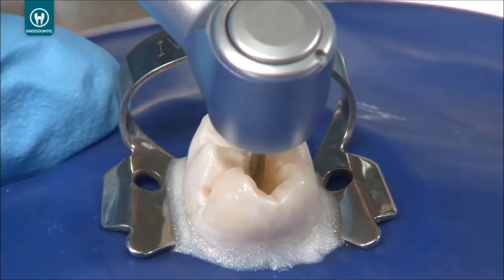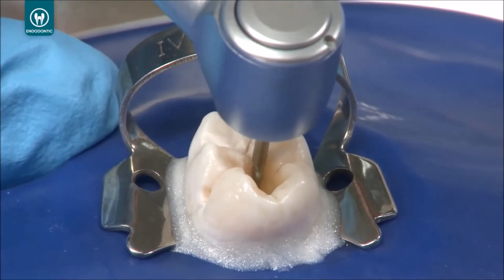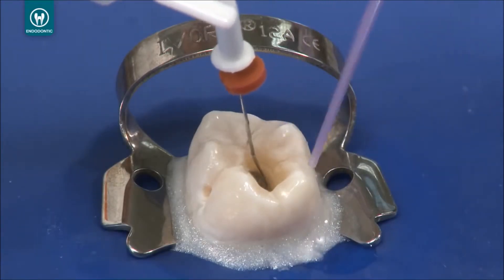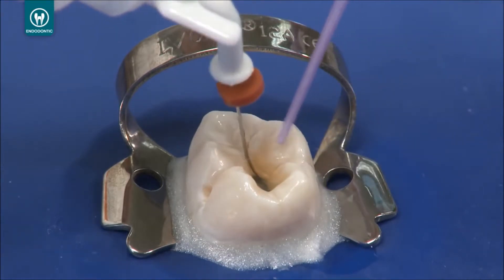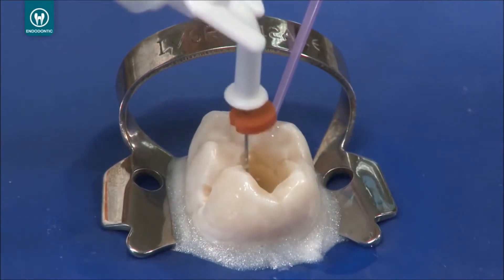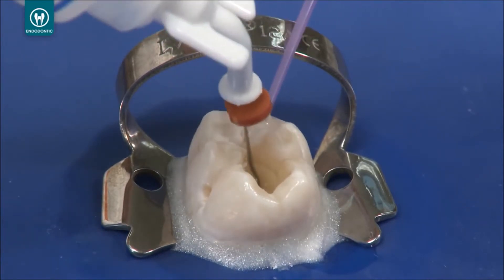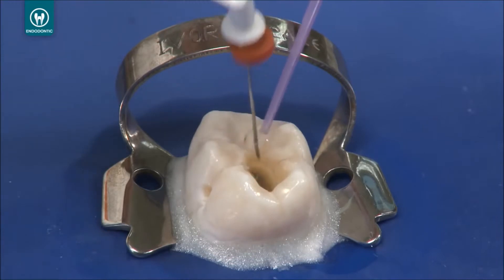Pre-flare the canal to partially remove canal contents and establish patency to your temporary working length. To ensure proper apex locator measurements, verify that the canal is not completely dry. Fill the canal with an electrolytic solution, like chloracid or chloracid V 3% sodium hypochlorite, to ensure a good conductive medium for a proper signal and readout.